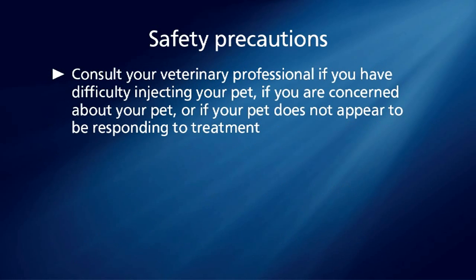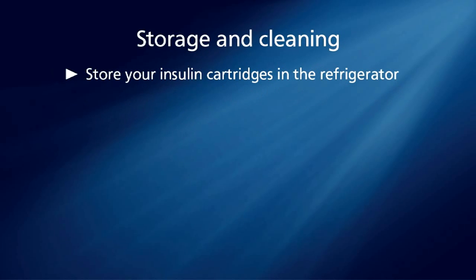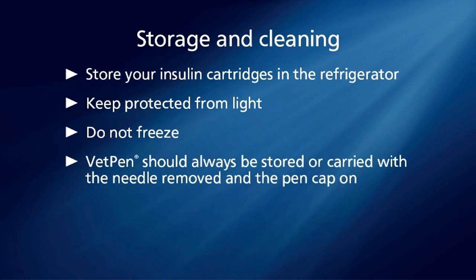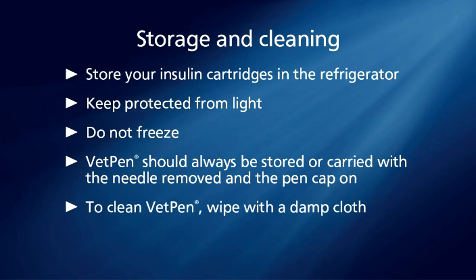Be sure to consult your veterinary professional if you have difficulty injecting your pet, if you are concerned about your pet, or if your pet does not appear to be responding to treatment. Before use, keep the insulin cartridges refrigerated and protected from light. Do not freeze. For further guidelines, check the approved Caninsulin package insert. VetPen should always be stored or carried with the cap on and no needle attached. To clean VetPen, wipe it with a damp cloth. Do not immerse it in water.